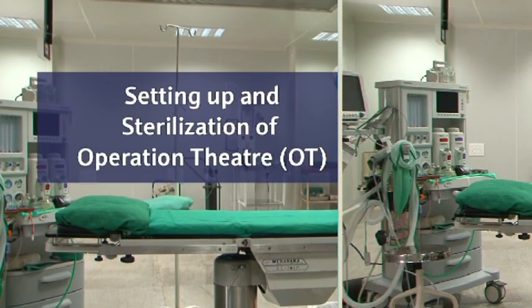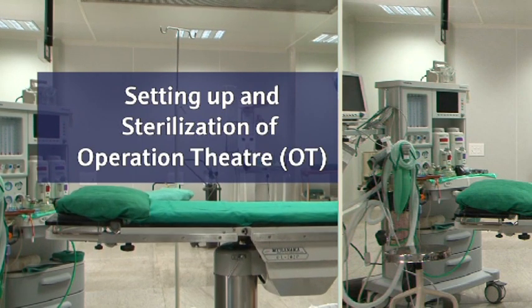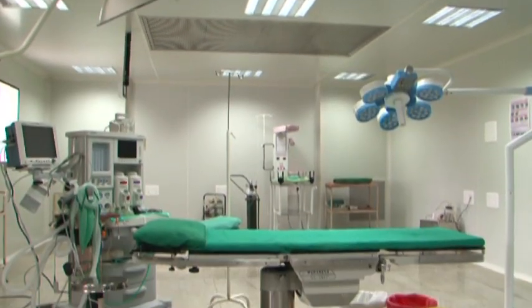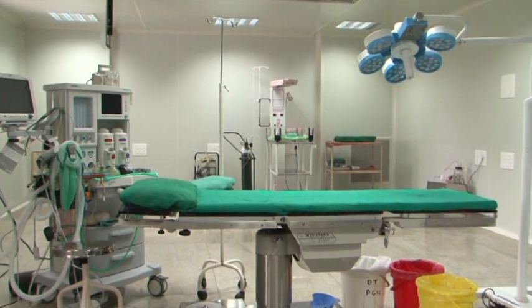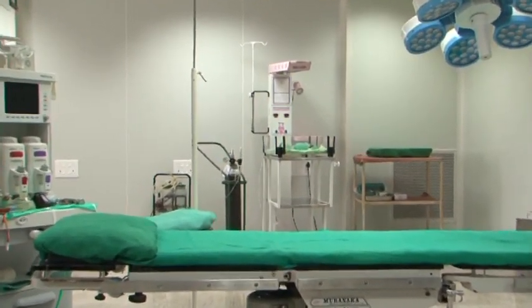Setting up and sterilization of operation theatre. Learning objective: to organize operation theatre in a systematic and planned way with all essential equipment and drugs in functional state, for ensuring sterility and keeping operation theatre free of microorganisms and smooth functioning.